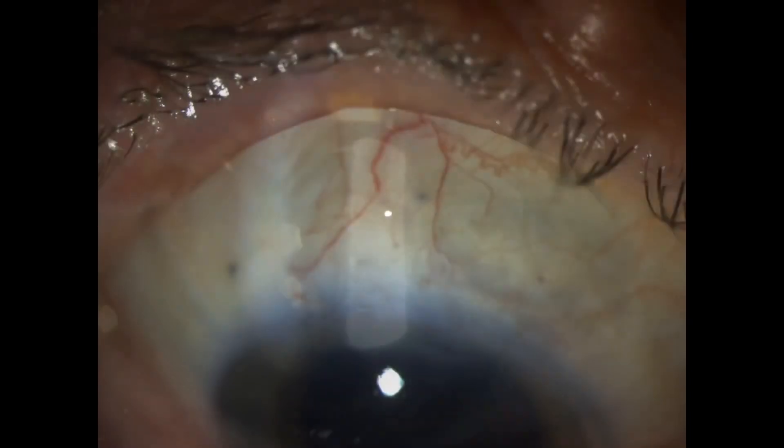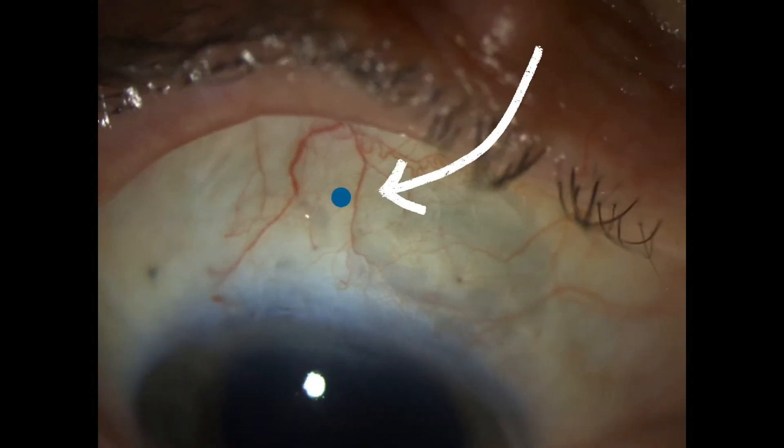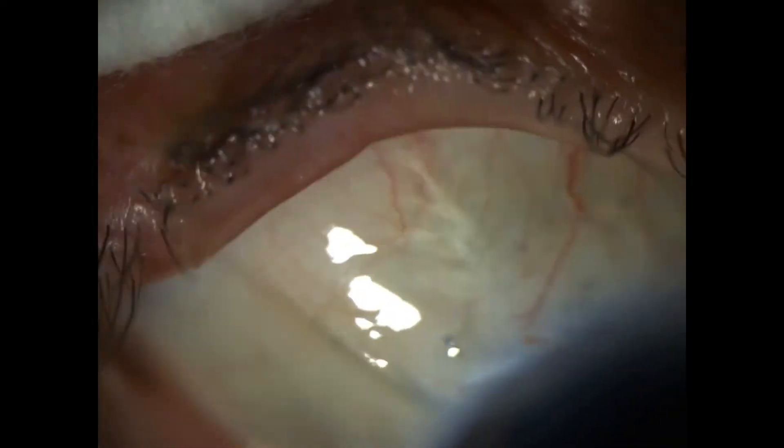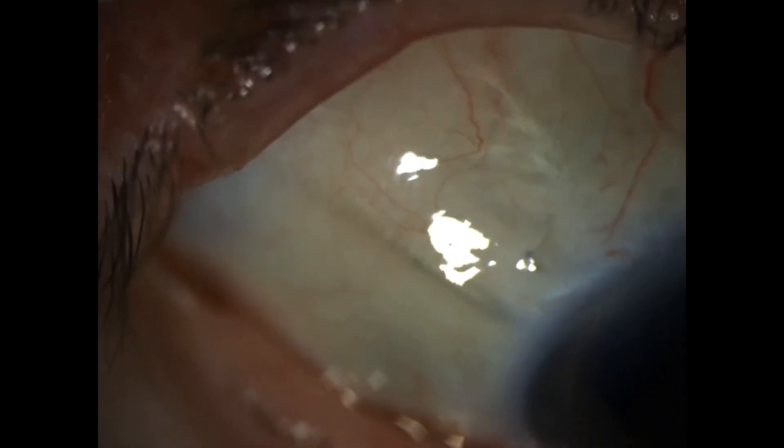When we zoom in, you can see that tiny blue dot — that's the flange of that haptic just underneath the scleral wall. Incidentally, this patient also had a previous Ahmed valve implant.